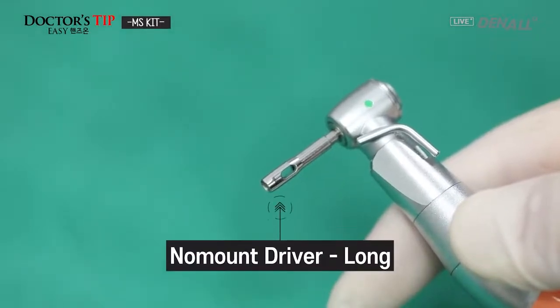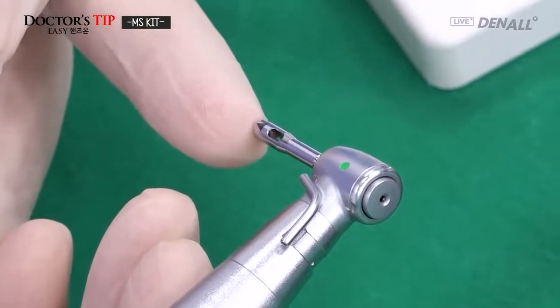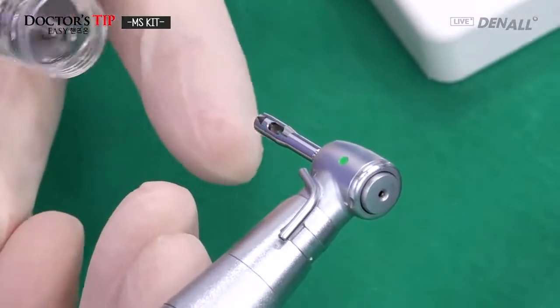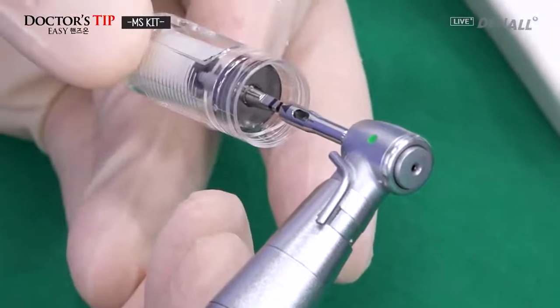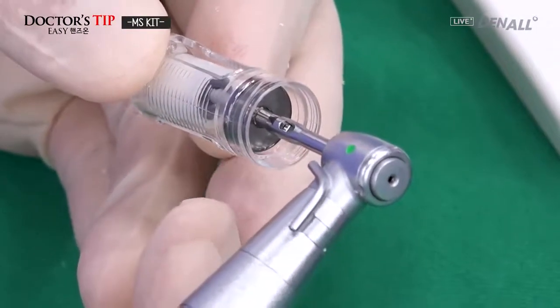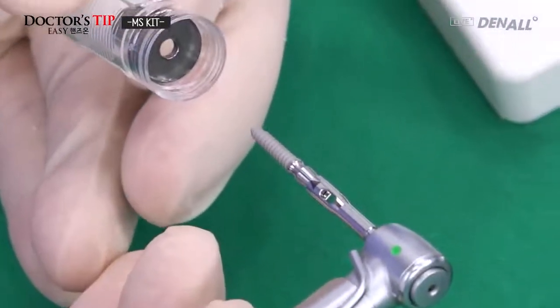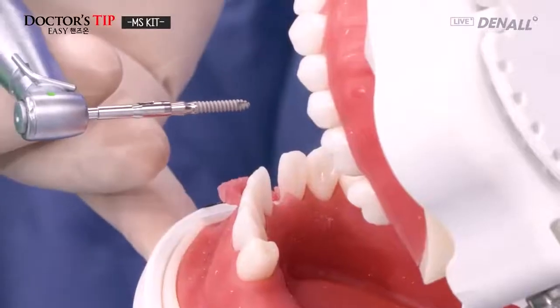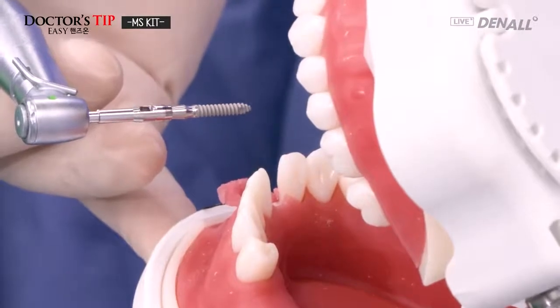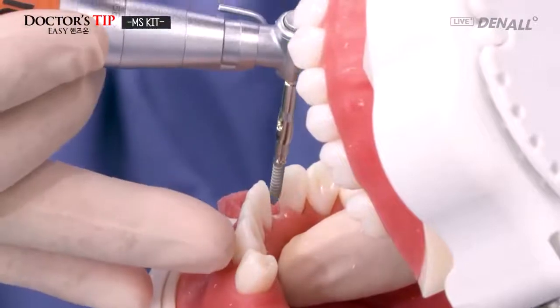And change to the placing mode, which is marked with the triangle, and that needs to connect to the MS fixture's flat part like this. Connect, and you pull it out, and like this. Before pushing in the mouth, you check that it's in the correct mode, and then place the implant.